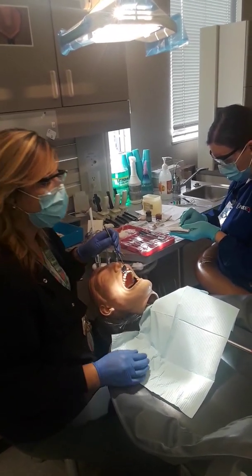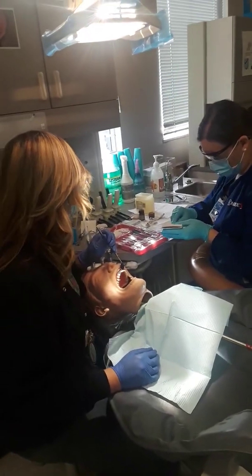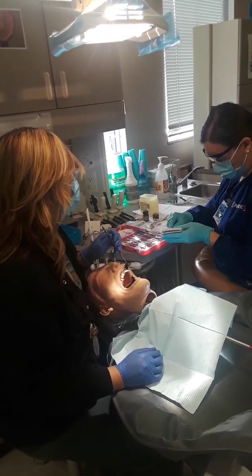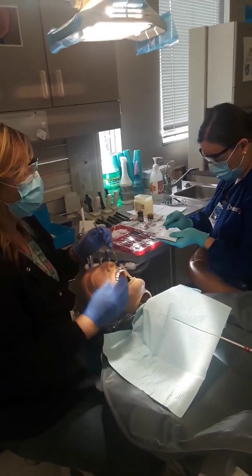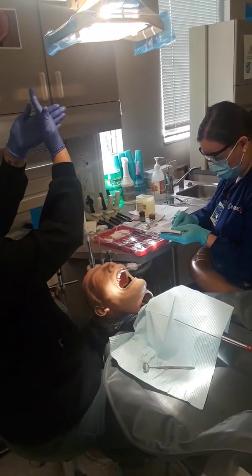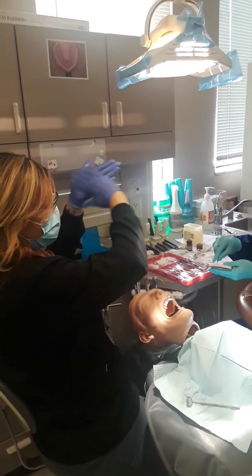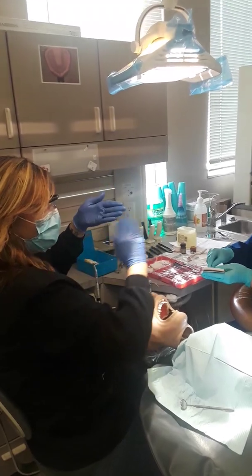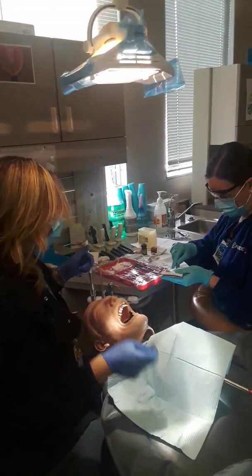So we deviated a little bit. We're not using a spatula, we're using a Woodson because the spatula is not present. But you should want a spatula to use. When you use a spatula, you're going to use the whole spatula and smash, making a figure 8. Then lift up, smash, making a figure 8 to mix. And then go the other direction, horizontal and then vertical. Okay? Figure 8. You're good.